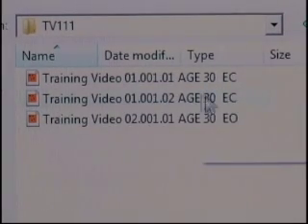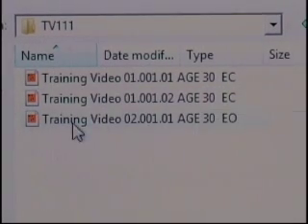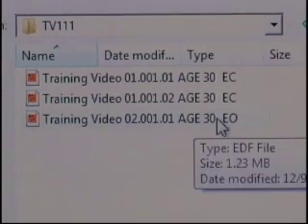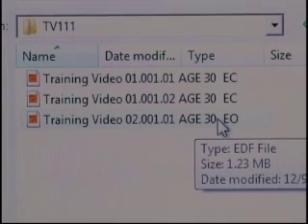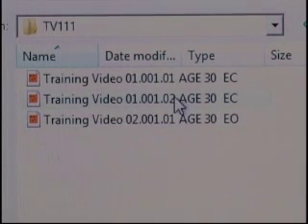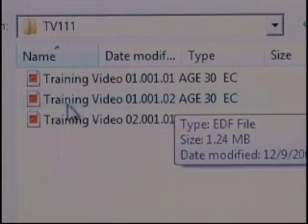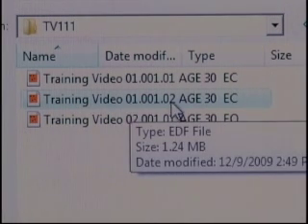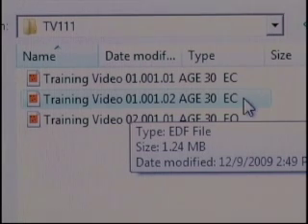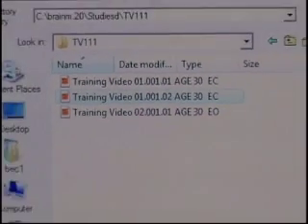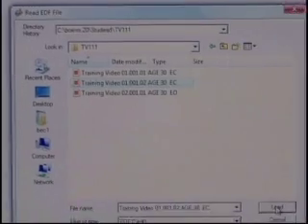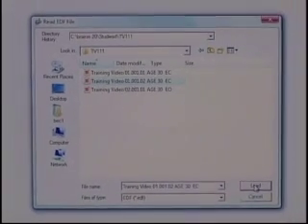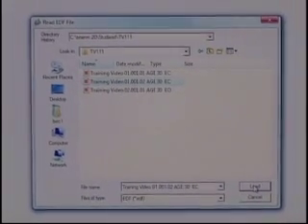And I have my eyes open, two minutes. So similarly to when we read into EDF Browser, we're going to go ahead and pick session one, run number two, eyes closed. We hit the Load button and the file will start to load into NeuroGuide.